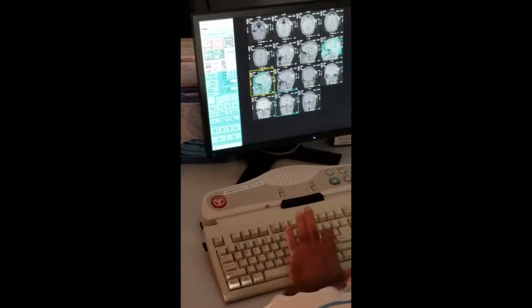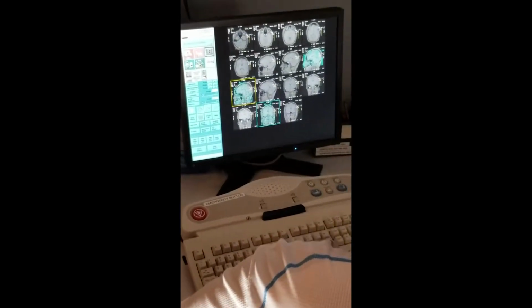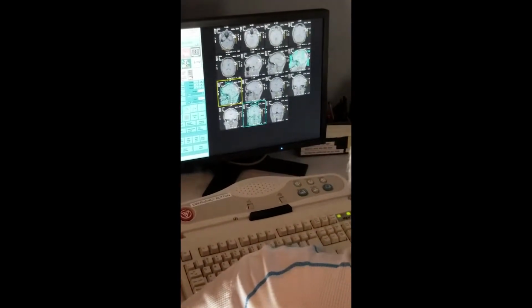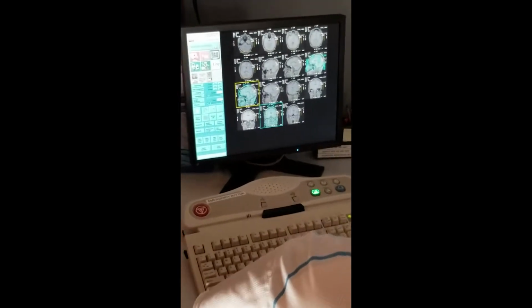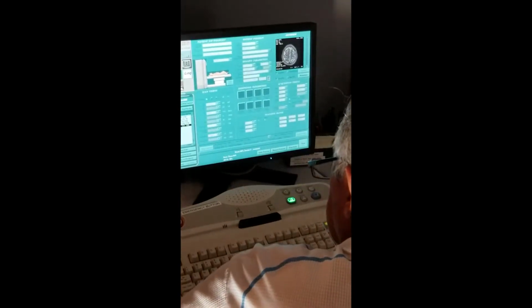The radiologist is asking for this? No, we asked. Okay. Is that hard to remember? XR space and then series numbers. Series number. This is to cross-reference slices. Correct. All right. So now, let's go back to here.